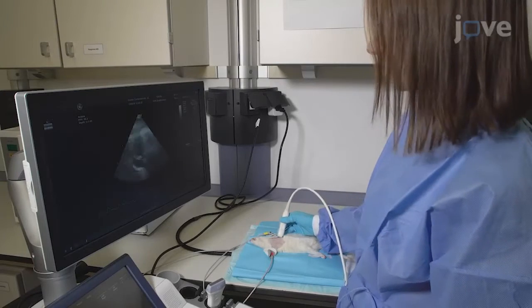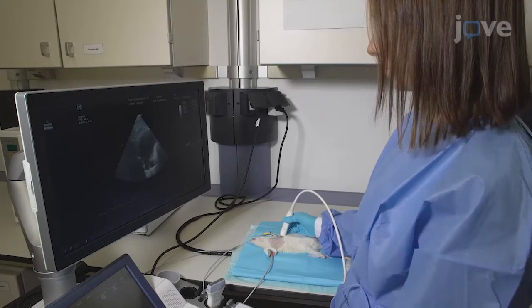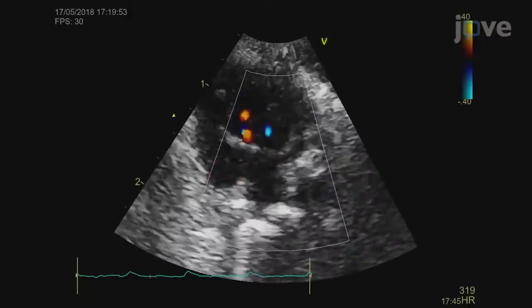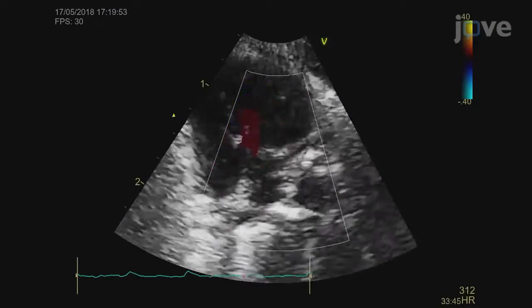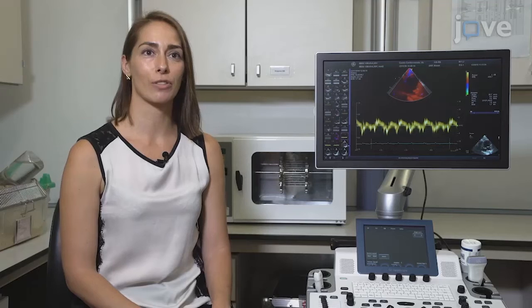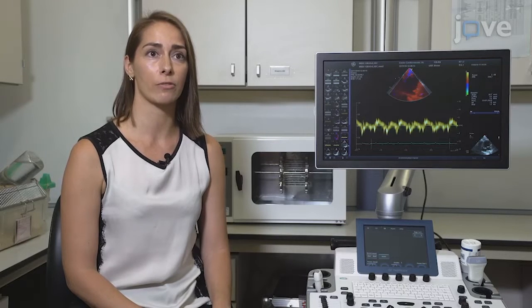The heart chamber size and left ventricular systolic, diastolic, and valvular function can be acquired by different echo views through the left parasternal, apical, and suprasternal windows. A combination of ultrasound imaging, Doppler flow, and tissue Doppler assessment can be used to study heart chambers and their dilatation, left ventricle hypertrophy, and left and right ventricle function.